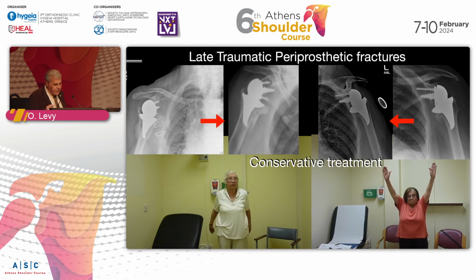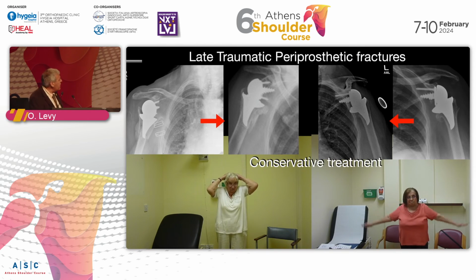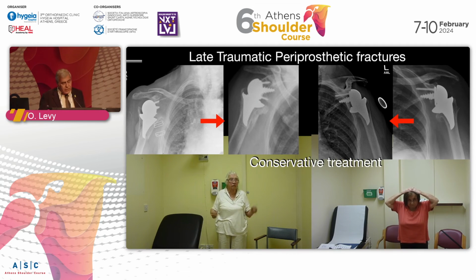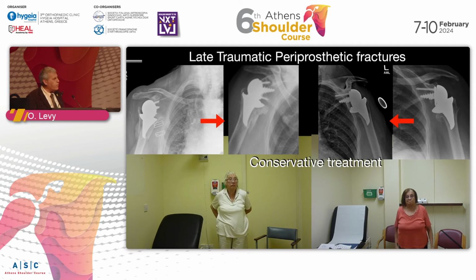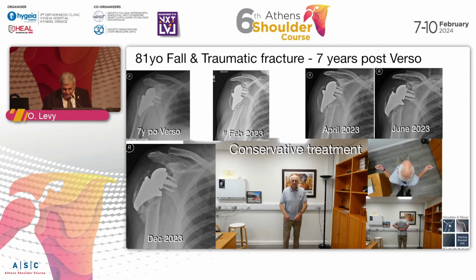Again, late traumatic periprosthetic fractures. Again, this can be treated conservatively. You see these two ladies, actually, they've got good function, maybe not as good as it was before the fracture, but you can treat it conservatively and it heals because it's metaphyseal. And we had 7 fractures in this series. 6 of them we treated conservatively, only 1 we had to operate was completely displaced.